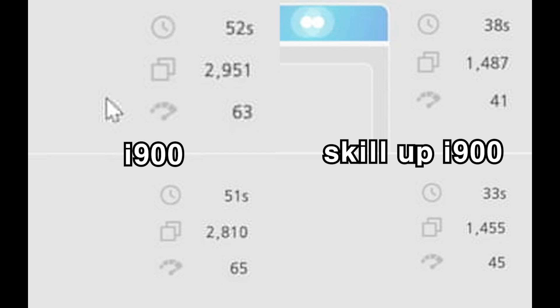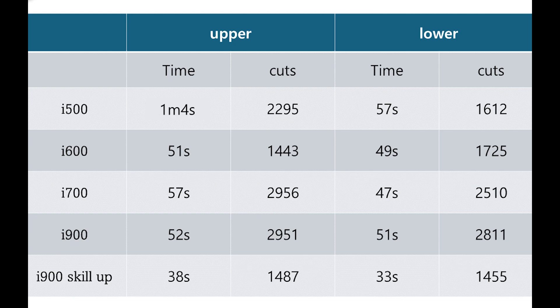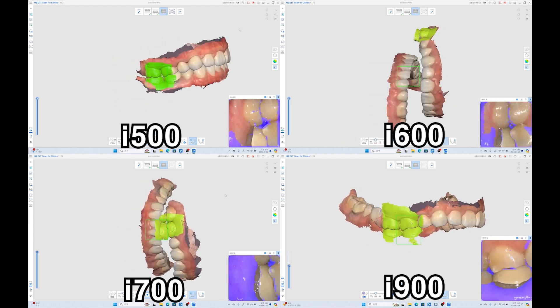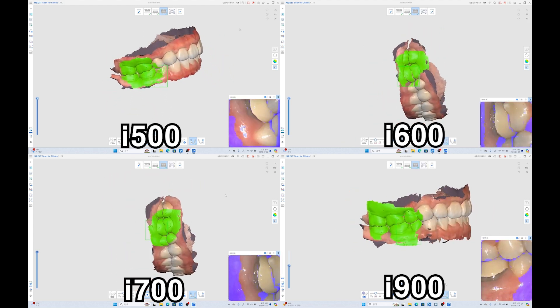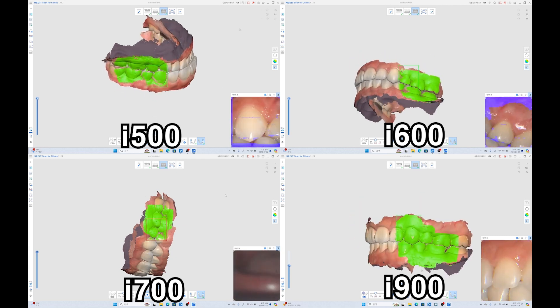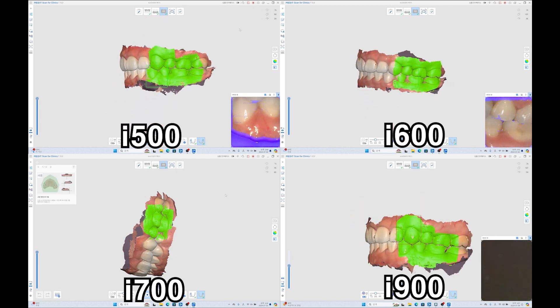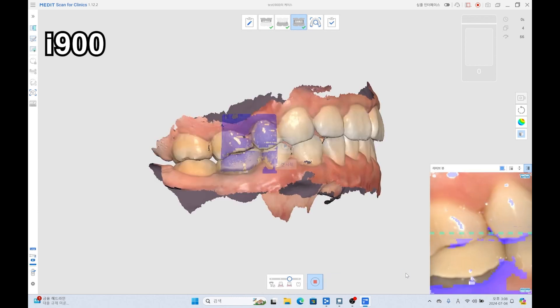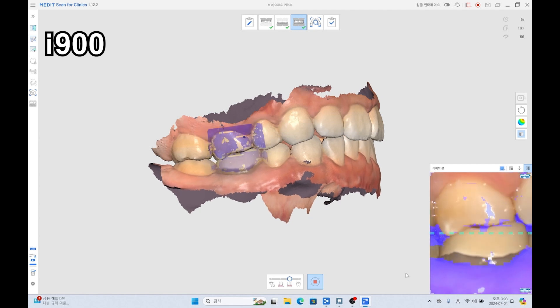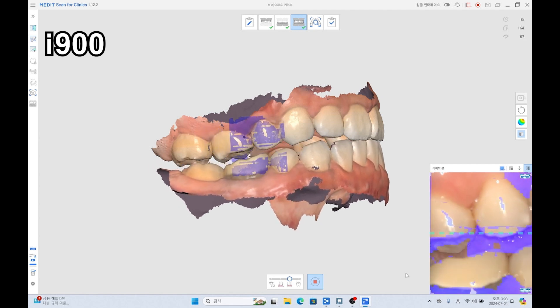After which, the scanning speed improved by an average of 31%. This can be linked to the fact that the I-900's field of view is 38% larger. In occlusal relationship scanning, although the duration is short and may seem to have little difference, the I-900's larger field of view allows for easier alignment with just slight movements. The enlargement of the I-900's tip has improved tooth capture during mandibular movements, leading to enhanced tooth recognition rates.